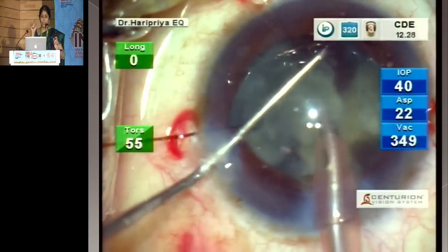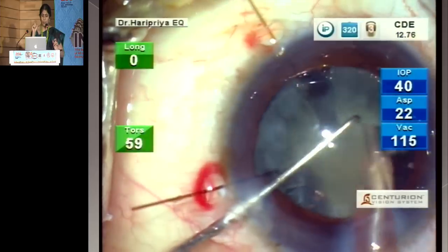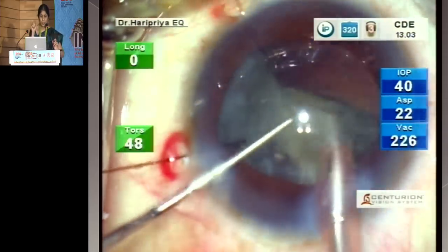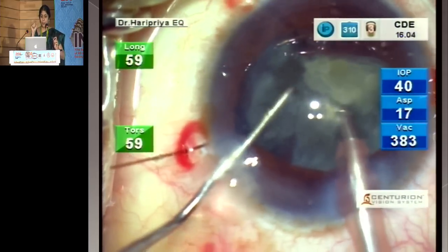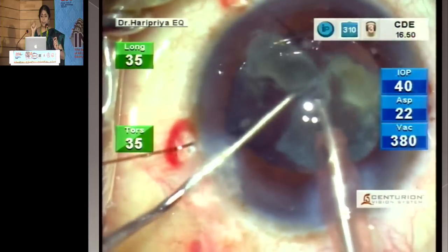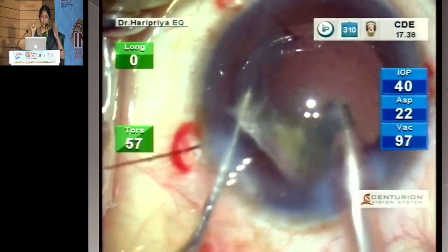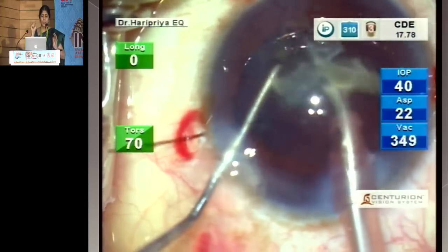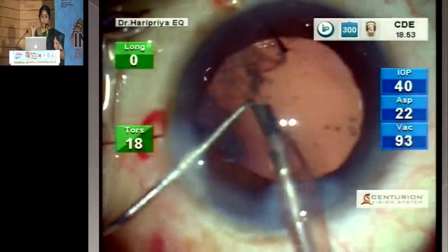This way, again, you don't have much endothelial damage. So reduce it, sub-chop it. Even if you have a bigger piece, hold it, make it as small as you need to, and then emulsify the fragments. Using these hooks is extremely useful during phaco as well, not just for inserting the CTR. Otherwise, you'll find the bag will be wobbling, and you'll have a higher chance of vitreous prolapse. The whole goal is that you don't want to have vitreous prolapse during the surgery.